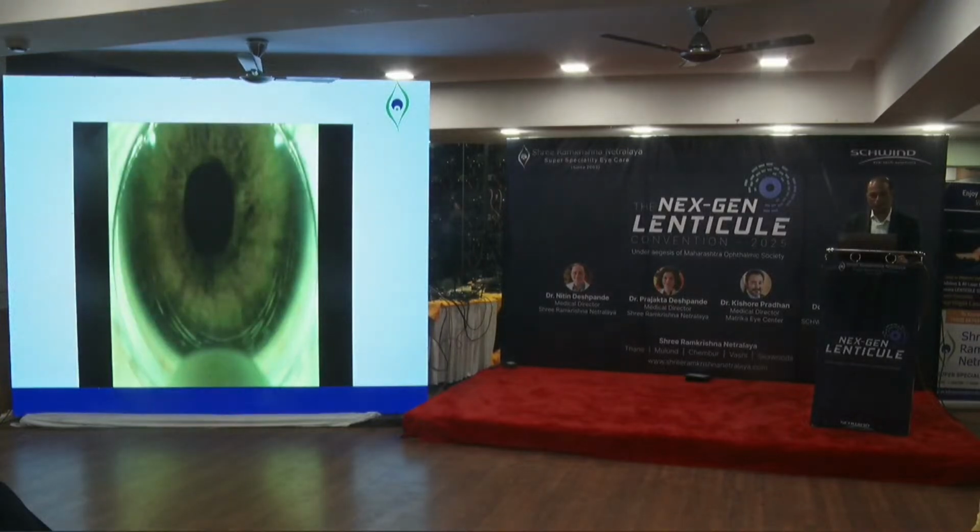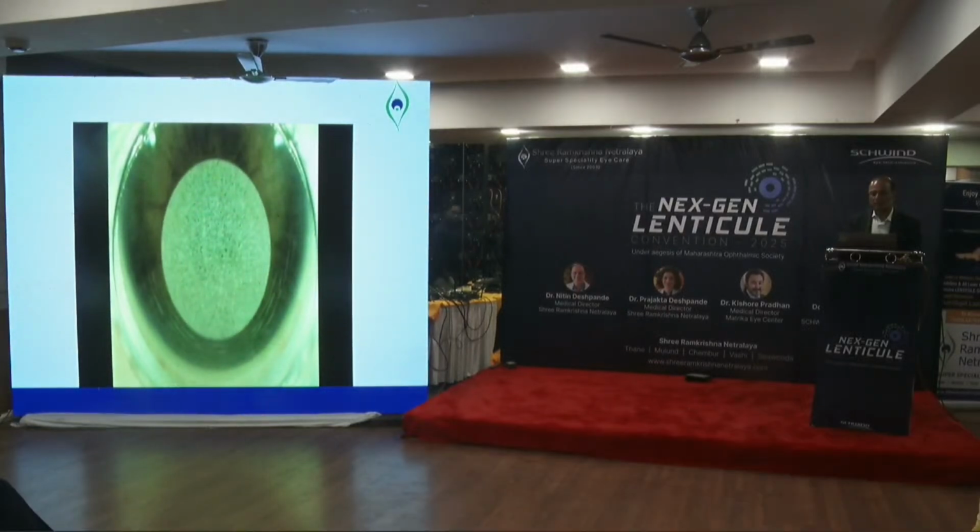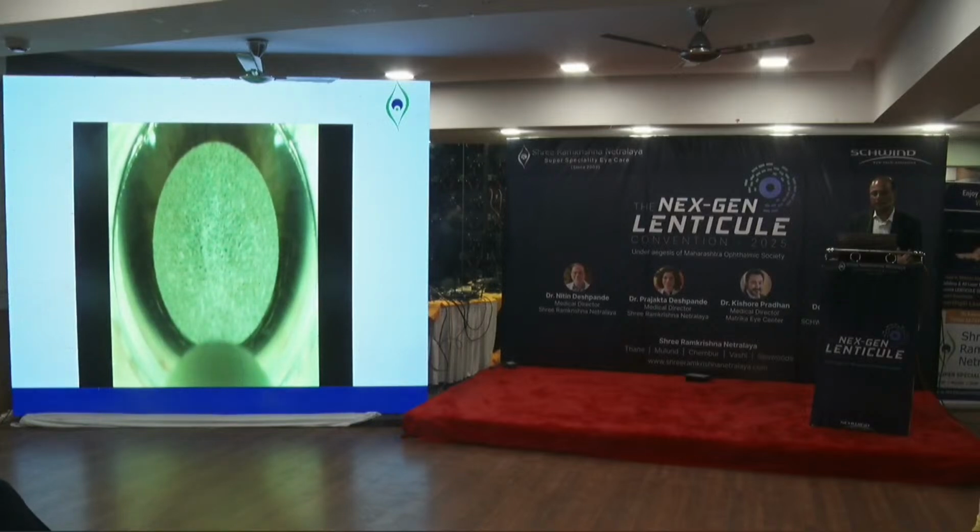So this is how the ablation takes place. It's a very fast laser, and you can see there's a centrifugal pattern. So this is a posterior refractive cut. All the cuts are done in 30 seconds, and then this is the cap cut. So this is centrifugal. Each machine has its own pattern.